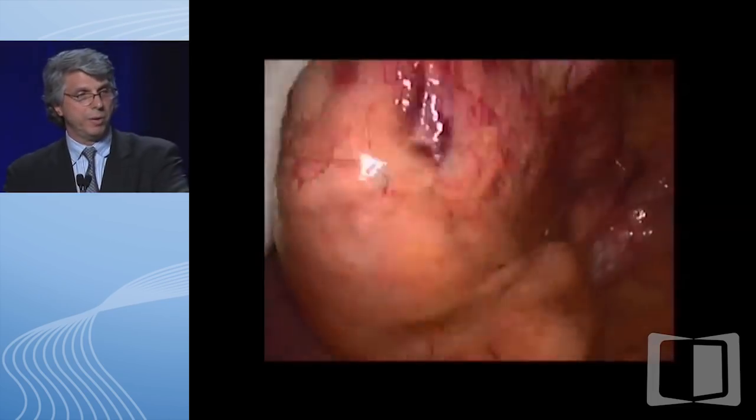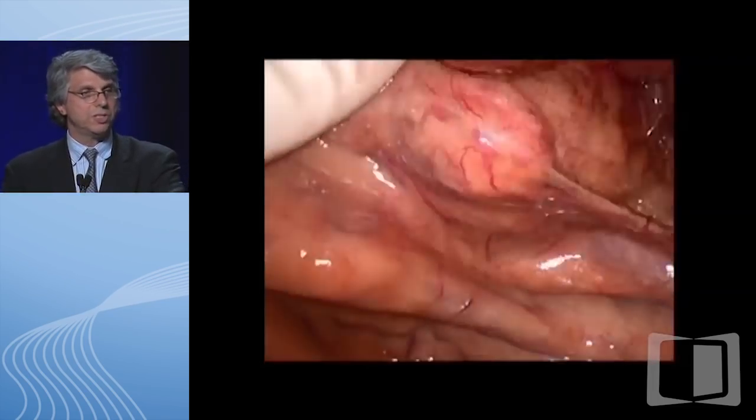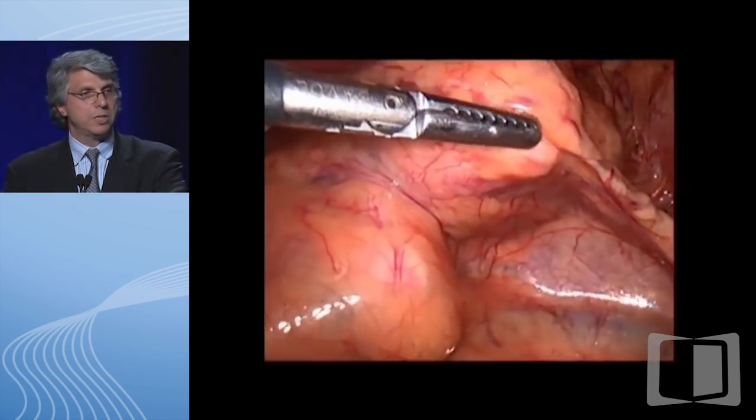After we identify the ileocolic artery, we identify the mesentery of the colon just distal to that and we incise it, gaining access into the mesentery. Now we start mobilizing the colon. We have not mobilized any of the colon or divided any of the colon at this point—we could actually leave the surgery here if we wanted to.